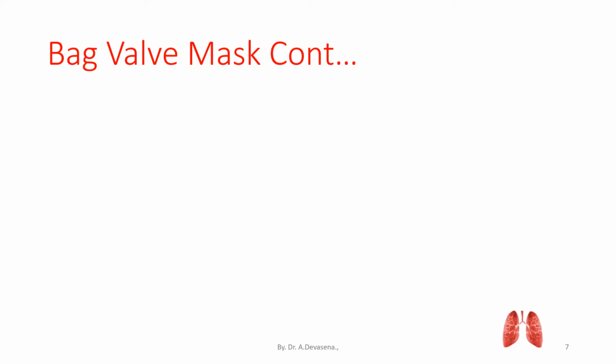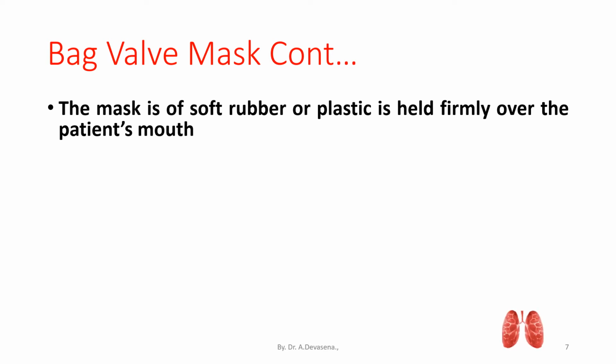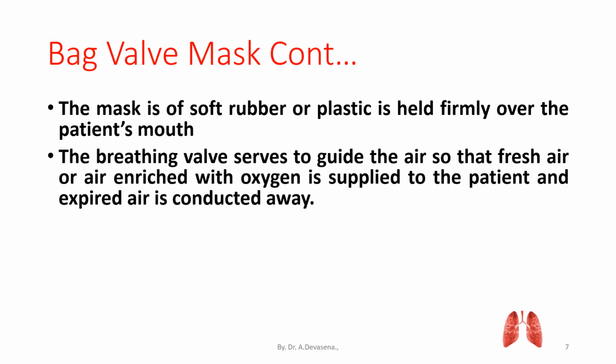Bag valve mask. The mask, of soft rubber or plastic, is held firmly over the patient's mouth. The breathing valve serves to guide the air so that fresh air or air enriched with oxygen is supplied to the patient and expired air is conducted away.